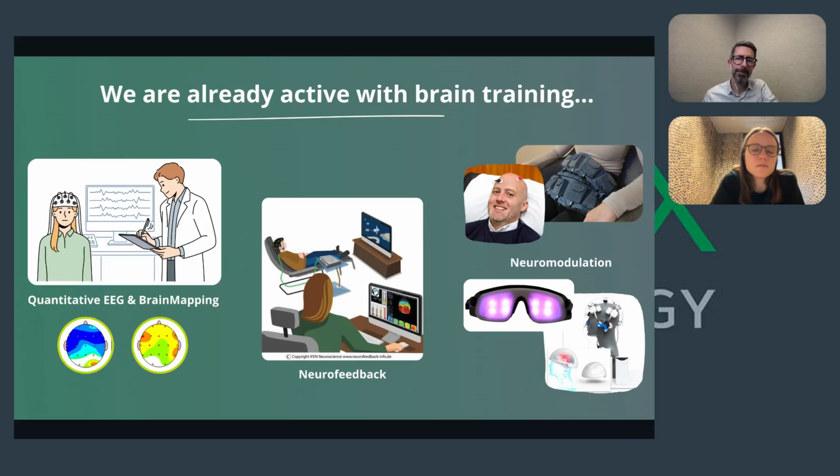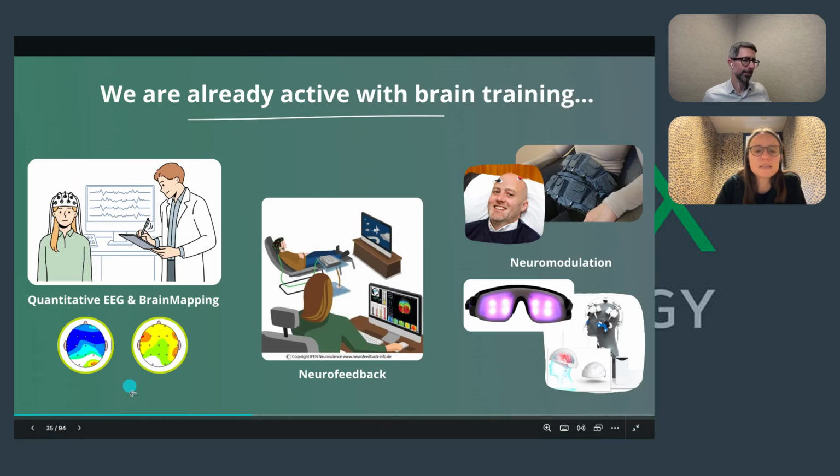That's where we see the dysregulation. We look at what we call the brain waves. That's what you see here on the screen, on the computer. From this, we can extract images like that and see, for example, this person has too much, let's say, beta brain waves. Too fast beta brain waves, too much, is a sign of anxiety. Here it's blue, so there is a lot of theta lacking, meaning struggling to focus and to fall asleep. It's precise information we can get.